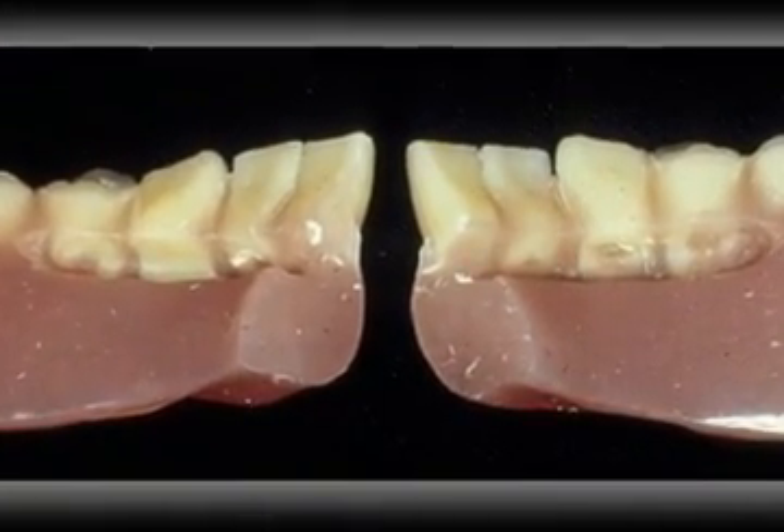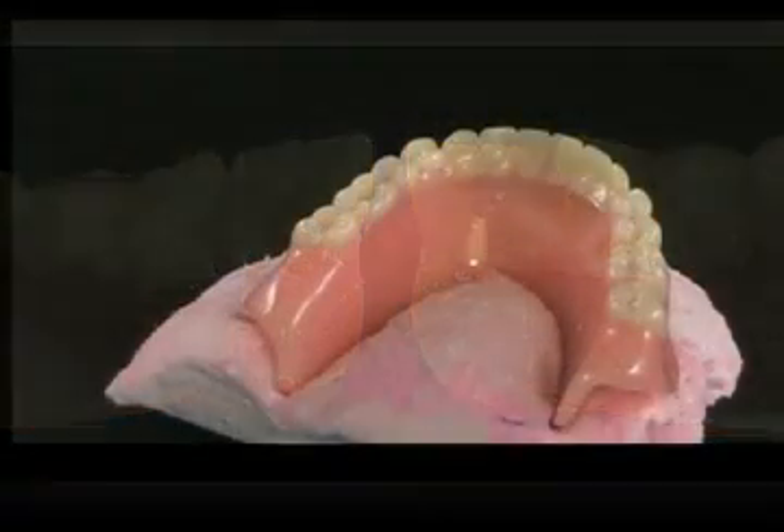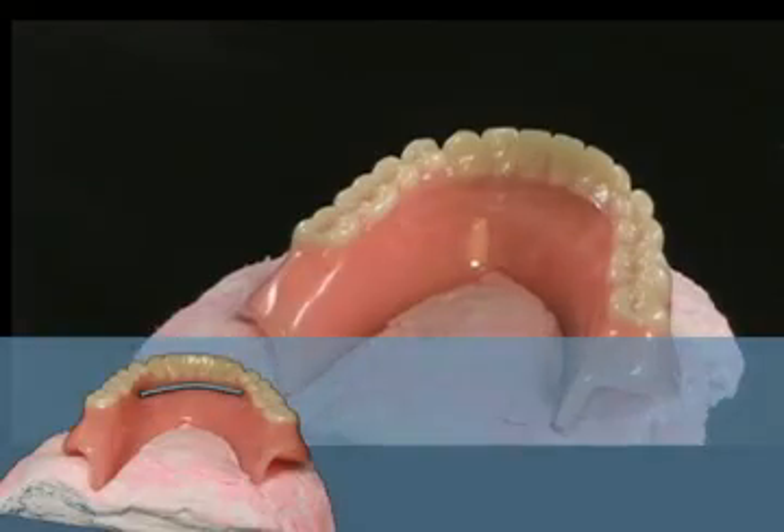Prepare a groove or ditch where the teeth join the acrylic resin on the lingual surface. Use a piece of wax rope to measure the length of fiber needed.